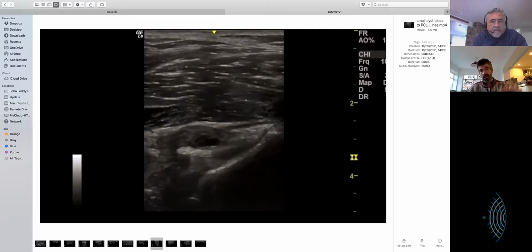Or if they can leave it straight, but sometimes it makes it deeper. And then I carry on scanning the tibial plateau, and you ignore the condyle because that's not your orientation. You see it, but you scan relative to the tibial plateau, and you should be able to scan the tibial plateau just about all the way around.